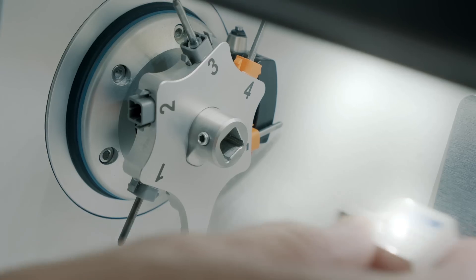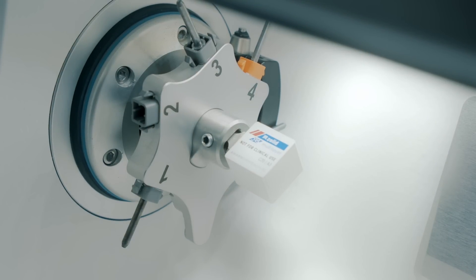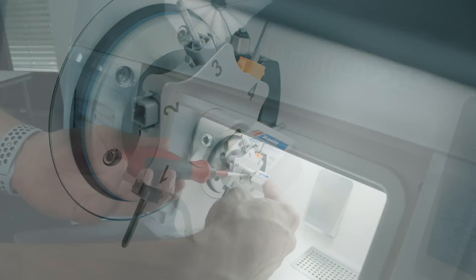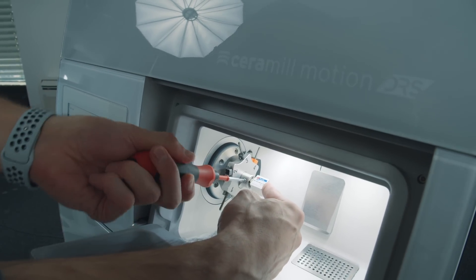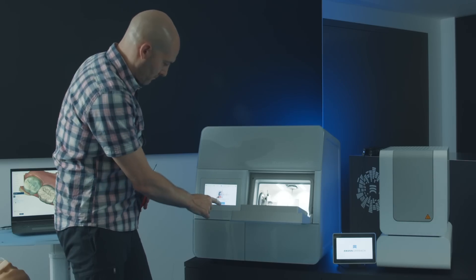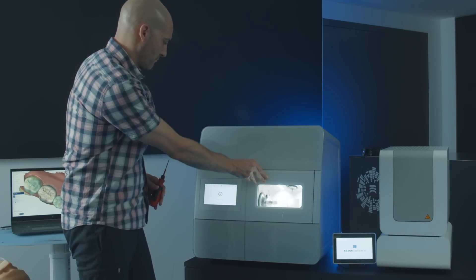Here I've decided to use a Solid DRS Speed Center zirconia block, which is a multi-color block with a color gradient. In order to properly fix the block into the holder, there is a small tool provided that allows you to tighten the screw to the necessary torque.